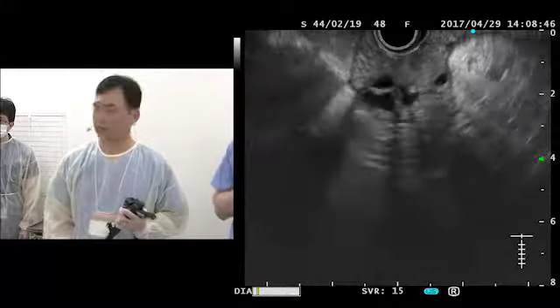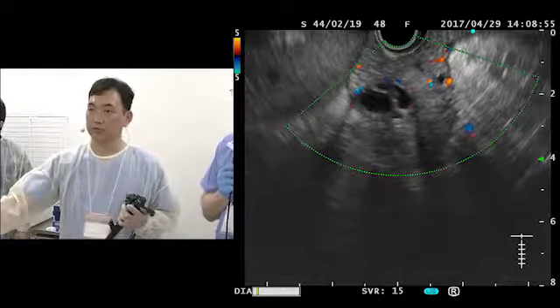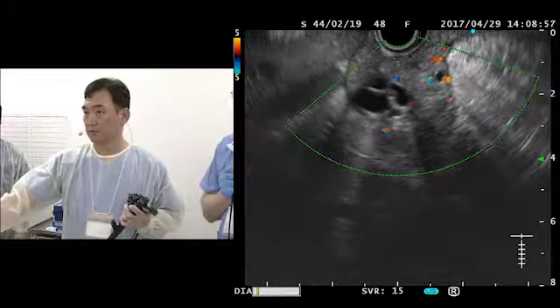So these are not engorged vessels, such as duodenal varices. Nowadays, Doppler is very sensitive. You can see the flow within the wall, within the venous structures as well. So this has to be cystic change within the wall. Could be lymphangiectasia. And we don't know exactly why it's present in this area.